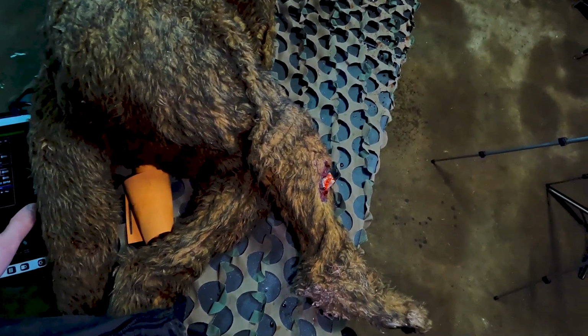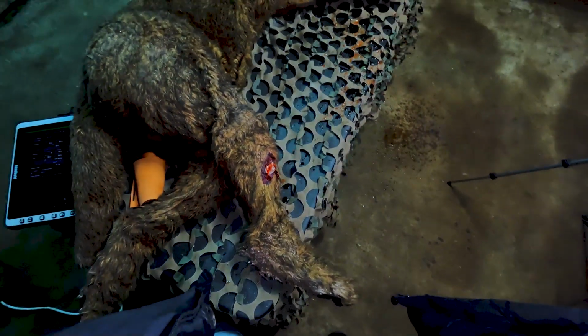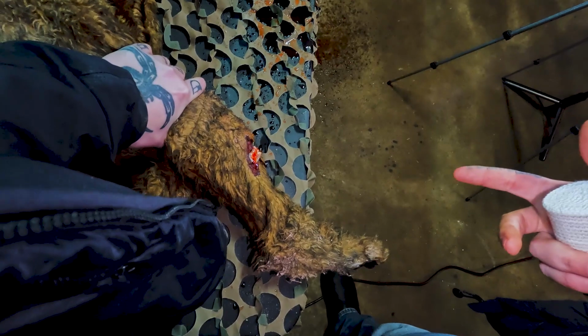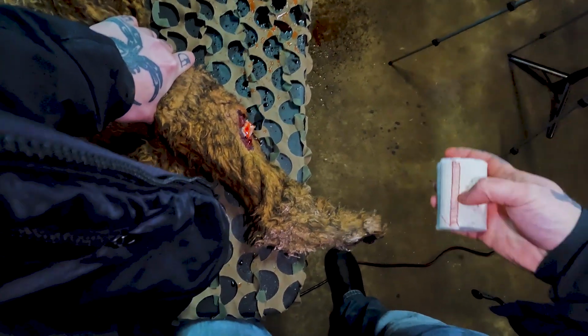When we start the bleeding of that, you can see it's bleeding. So if you have this kind of arterial spray, you immediately want to try to grab the leg. And so you can see that me grabbing this leg, which is a lot more rigid because it's mechanical, works to stop the bleeding, and it works the same way in a not robotic canine.